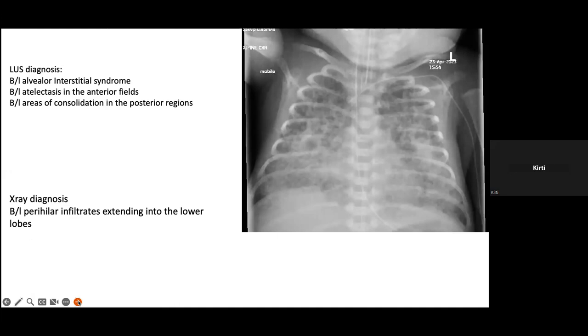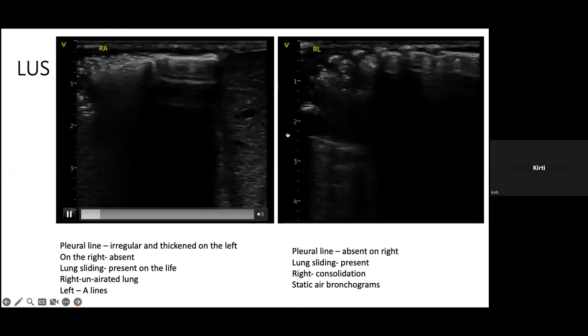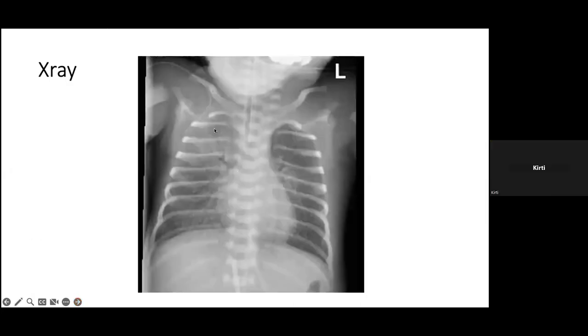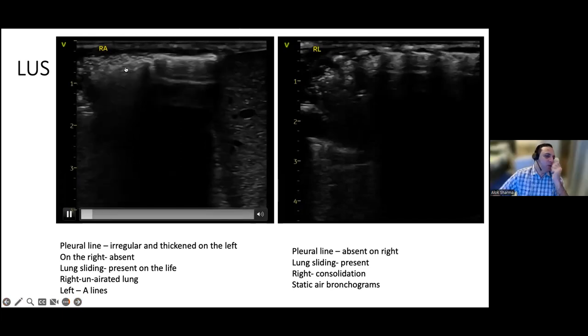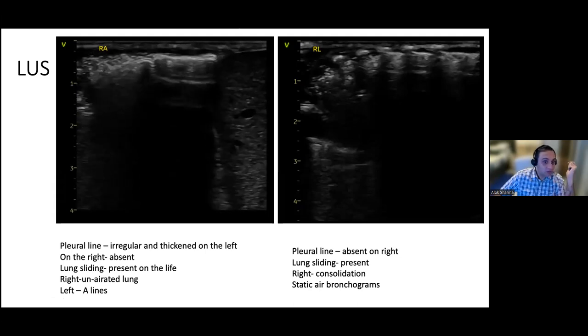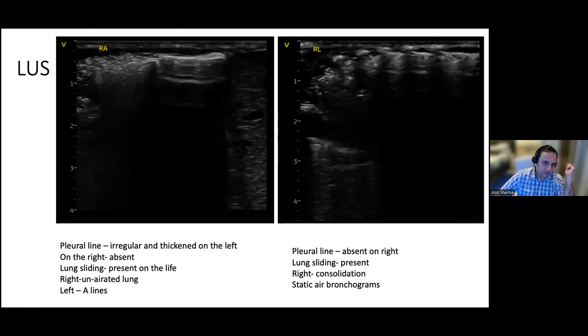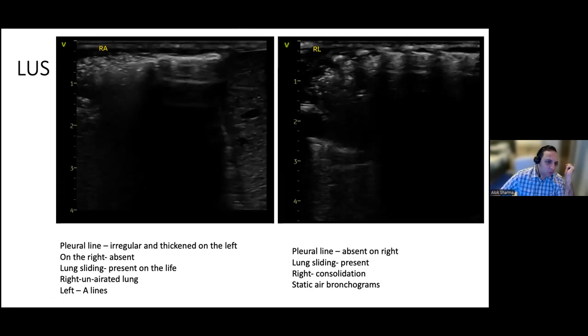Just because we wanted to discuss atelectasis, I've added another slide from a case I presented earlier, which had a more clear atelectatic area. And this baby's X-ray was this, on the right upper lobe. I think this is very similar to what you would see in a baby who's just born, isn't it? Without much aeration. Yeah, so you're right. So basically what you call an alveologram, where the pleura is not established at all. So I can't see any pleural line there. It's all irregular with what is a kind of a C profile. You then have aerated lung below it with the liver just below. So kind of a right upper lobe consolidation collapse is what you're thinking.